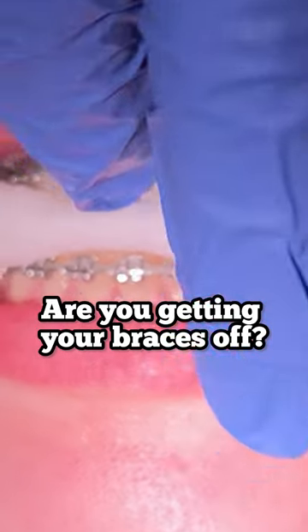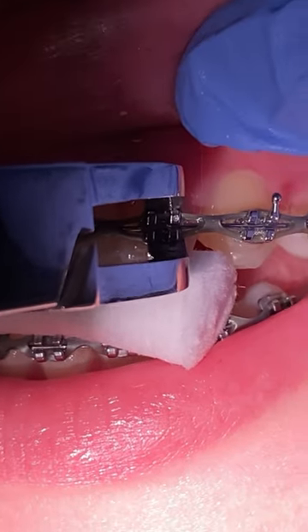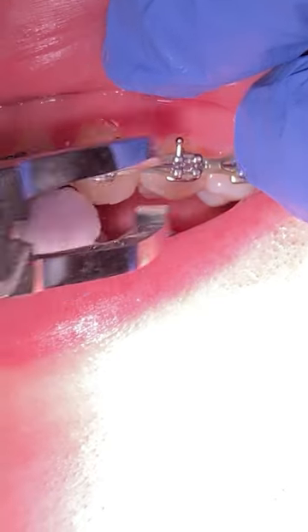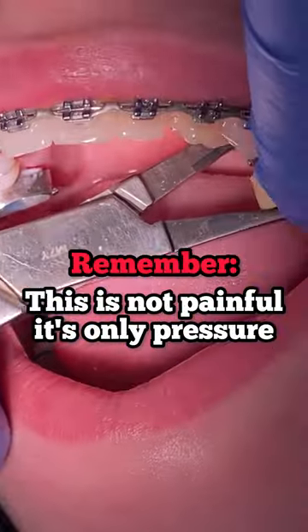Hey everyone, this is Abby your hygienist here at Town Family Dentistry. Today's video we're going to show you a de-band appointment. De-band is when we remove the brackets. As you can see here, we're removing the brackets and letting the patient bite down on a cotton roll. The cotton roll allows the patient to feel a little bit more comfortable and feel less pressure as we're removing the braces.